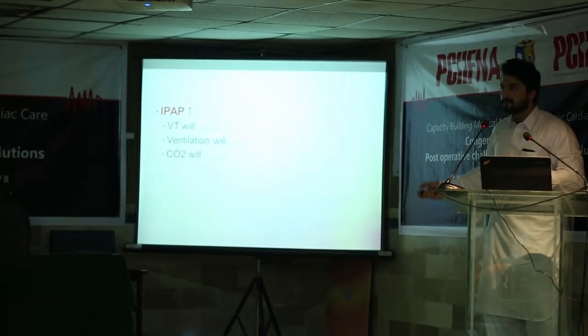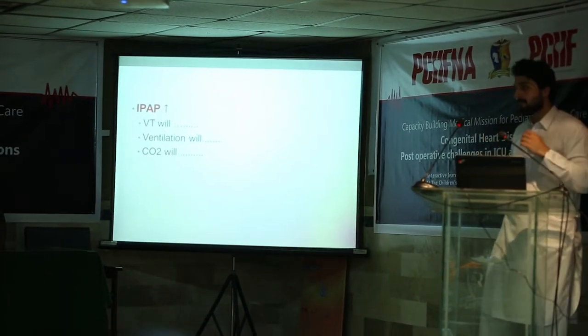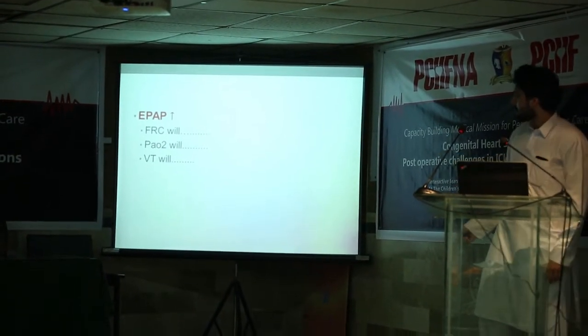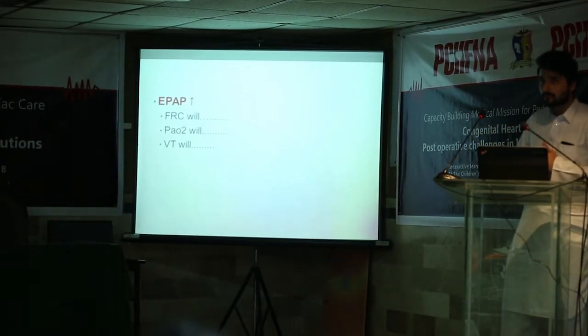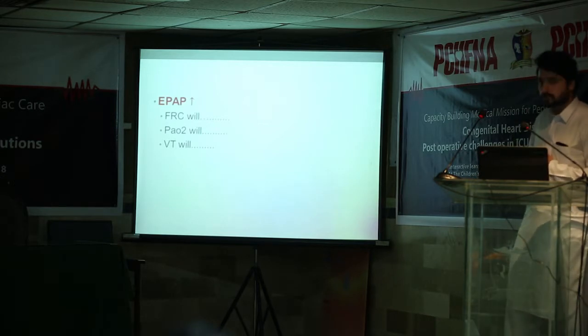Next one. If the IPAP is high, tidal volume will improve, right? And your ventilation will improve and CO2 comes down. Next one, EPAP. If you increase the EPAP, what happens to your FRC? It improves, right? And then your oxygenation, obviously, with more EPAP you get more oxygenation. And then your tidal volume will? Improve. EPAP will improve it indirectly, but not directly, because you're giving the recruitment, so with recruitment it will improve as well.